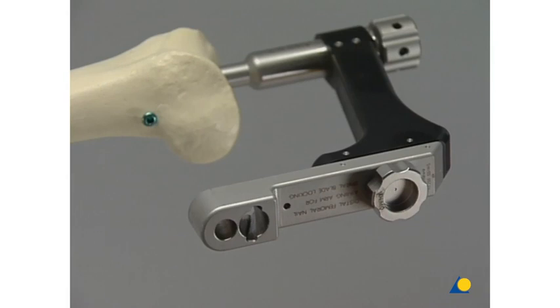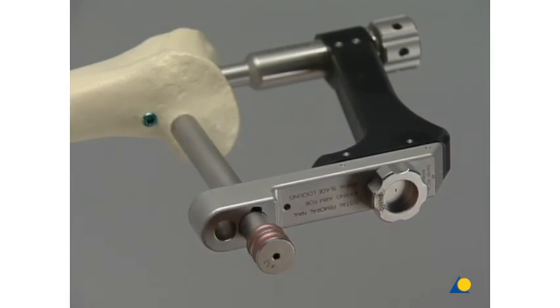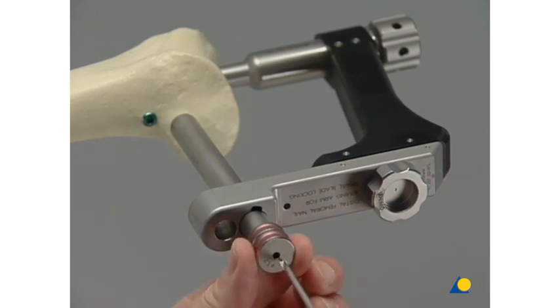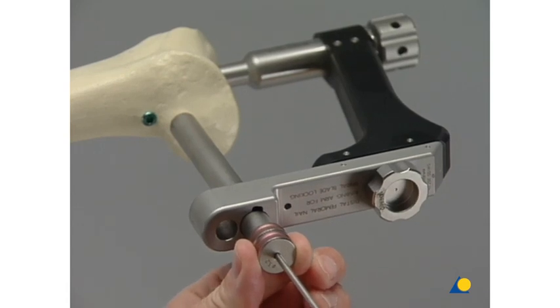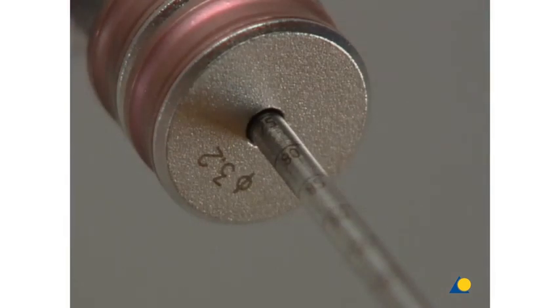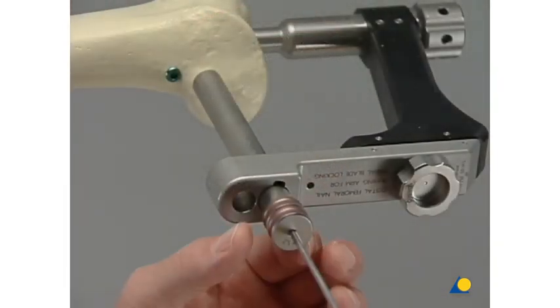The sleeve combination is inserted through the caudal hole on the aiming arm and advanced to the lateral cortex. The guide wire is inserted until its tip only just protrudes from the medial cortex. The length of the spiral blade to be used is read from the ring marks on the guide wire. Then the drill sleeve is removed.